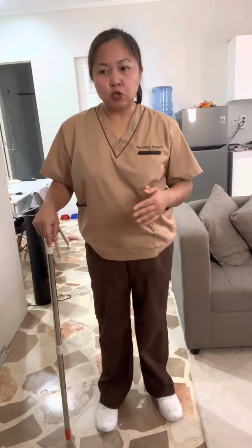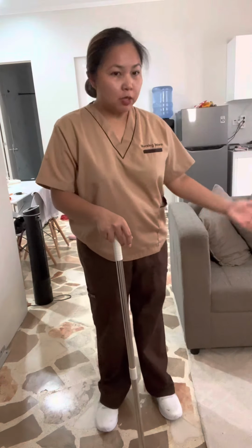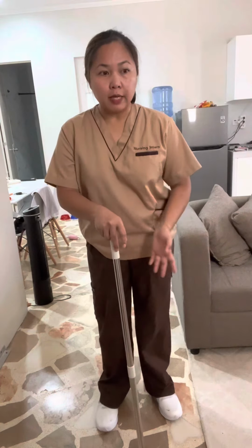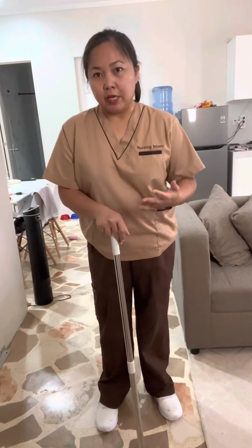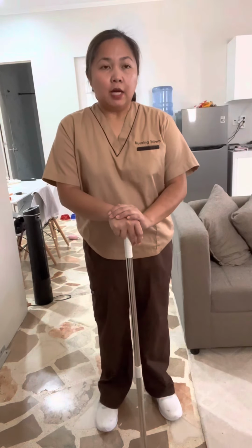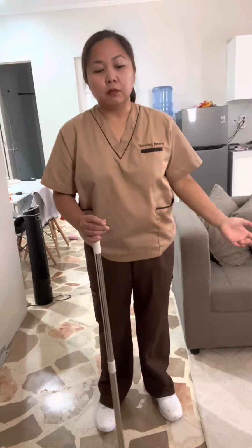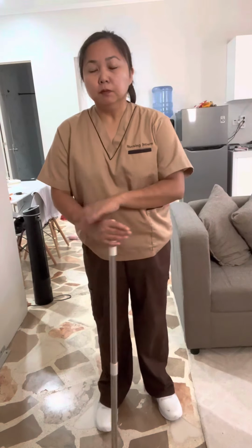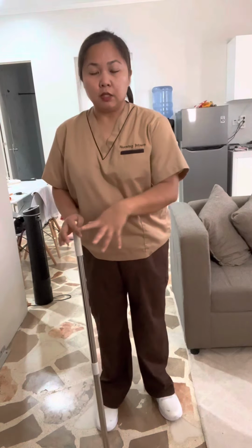And then once they reach their desired destination, make sure that you tell them that they can use their call light just in case they need some assistance or have any needs. Make sure that you clean all the apparatus after you're done. If they used the stand assist device, clean that properly, use your gloves, and then take off your gloves once you're done cleaning and discard all your disposables in the proper receptacle.